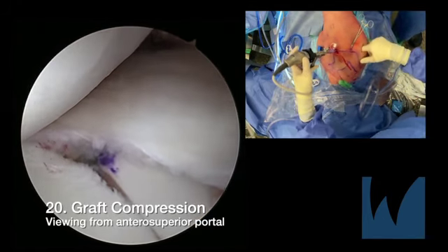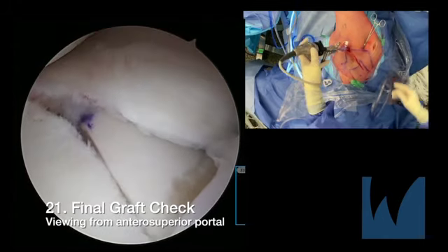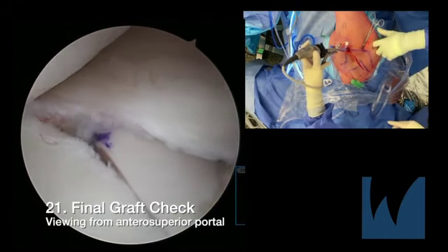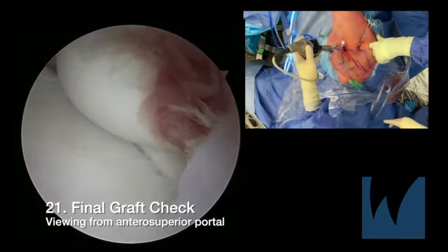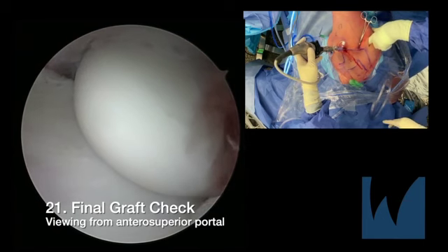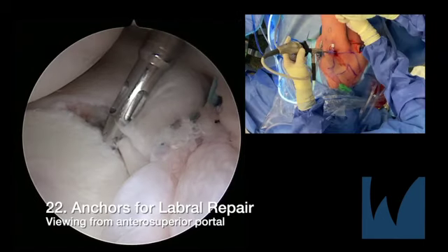To ensure there is no gap between the distal tibia allograft and the native glenoid, compress the graft using 5.6 mm partially threaded screws. Using your finger, insert into the joint to confirm that there is no step and there is a smooth articular surface reconstructed.